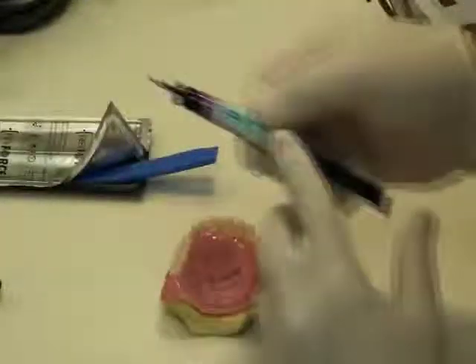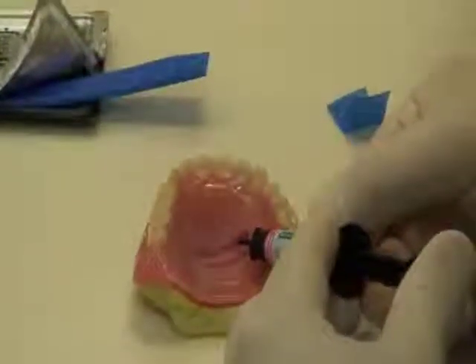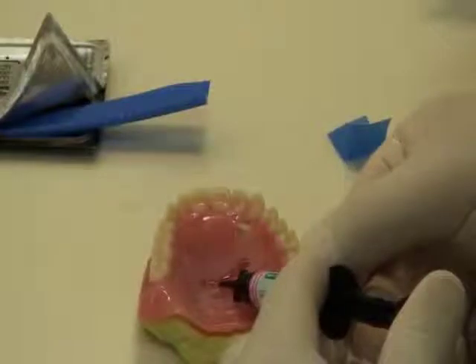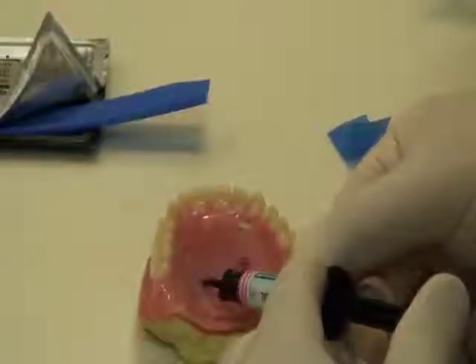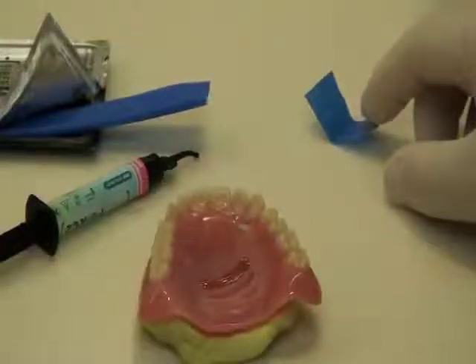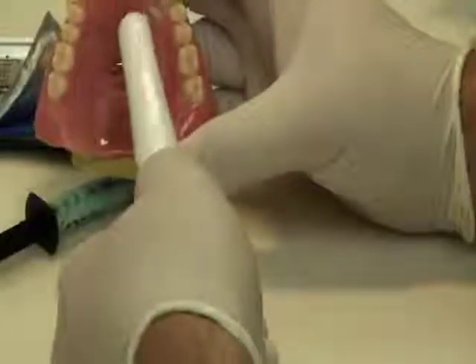Take the light cure resin and completely cover the Fiber Force. If during the trimming process some of the fibers become exposed, it's important to recover them with a thin layer of resin or acrylic — this will avoid possible tissue irritation created by exposed fibers. Light cure for the appropriate period of time with a handheld curing light or light oven, then trim and polish as required.